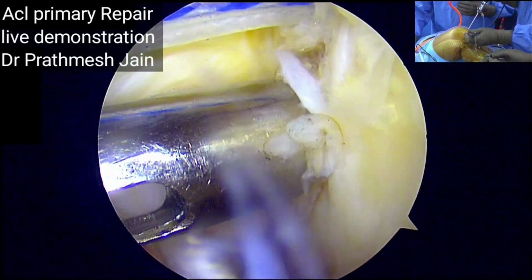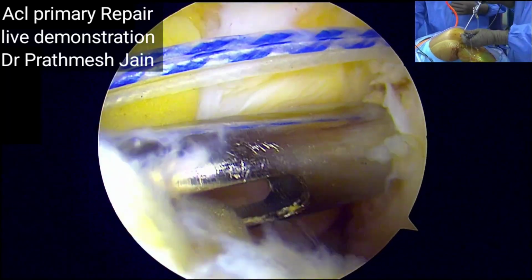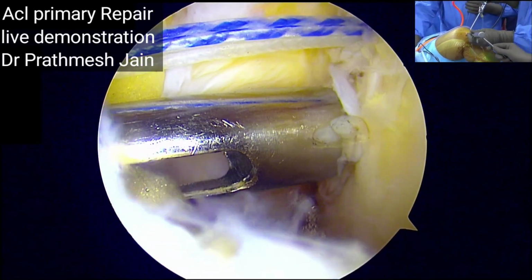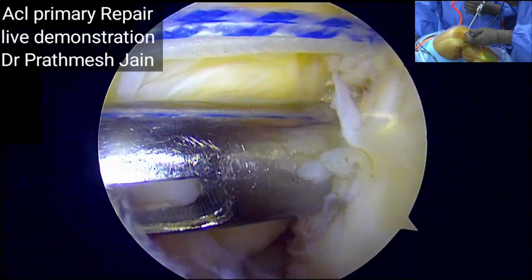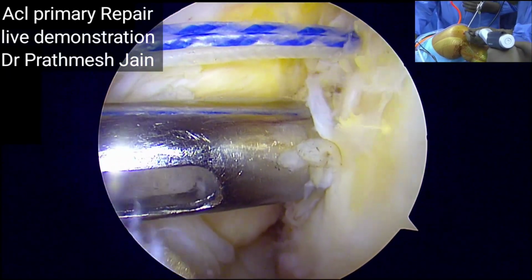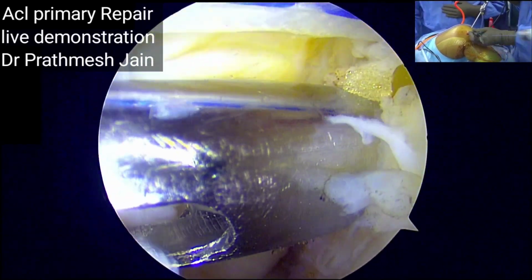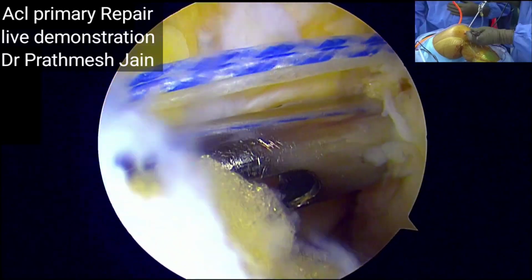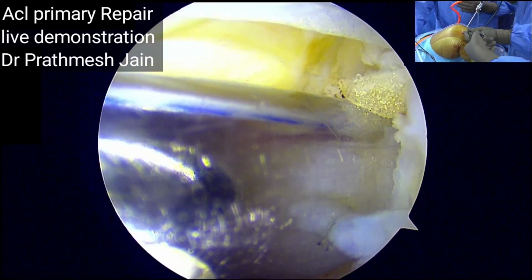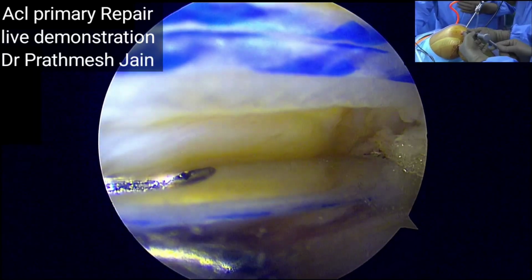And now I would be inserting my second anchor. This is basically for the PL bundle or the posterolateral bundle. So you can see that this is for the PL bundle or the posterolateral bundle. Very good. And both of these will also give rise to a lot of bone marrow elements which are coming, which are helpful for the healing per se.